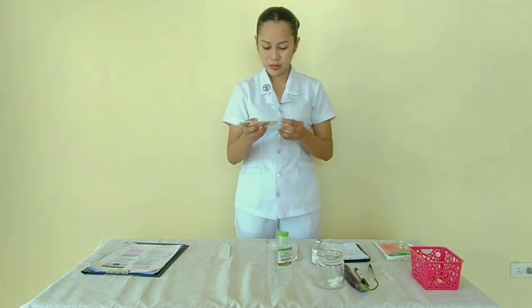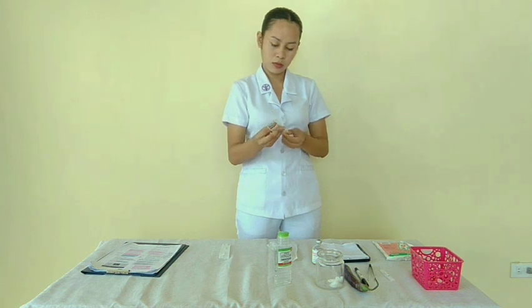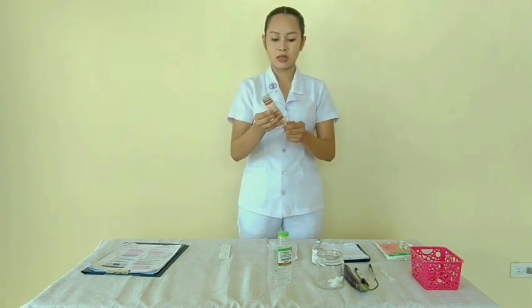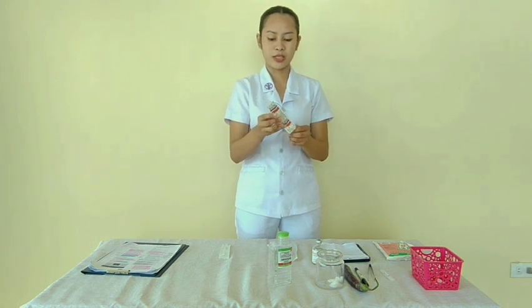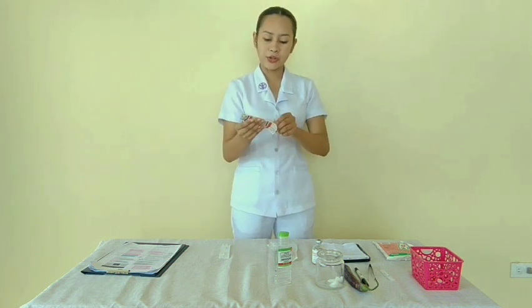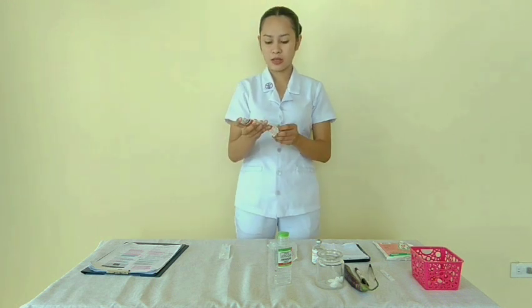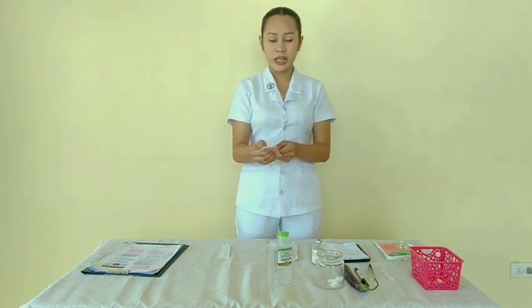So I have here. Then connect my syringe with the aspirating needle, and then we also need to ensure that the needle is firmly attached to the syringe by rotating it. Now remove the cap of the needle.